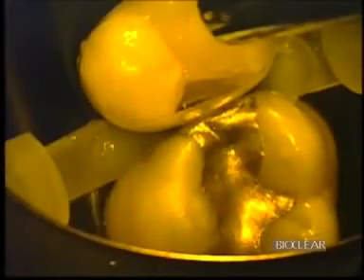Now that the dentin has been taken care of, we're going to move to injection molded composite dentistry. This is very exciting. Now I am going to place the final application of bonding resin. We're going to air thin the occlusal very aggressively, but I'm going to leave a slight reservoir down on the gingival margin. This is because we're going to inject our flowable composite directly into that reservoir. This is the key to eliminating voids and gaps along the margin.